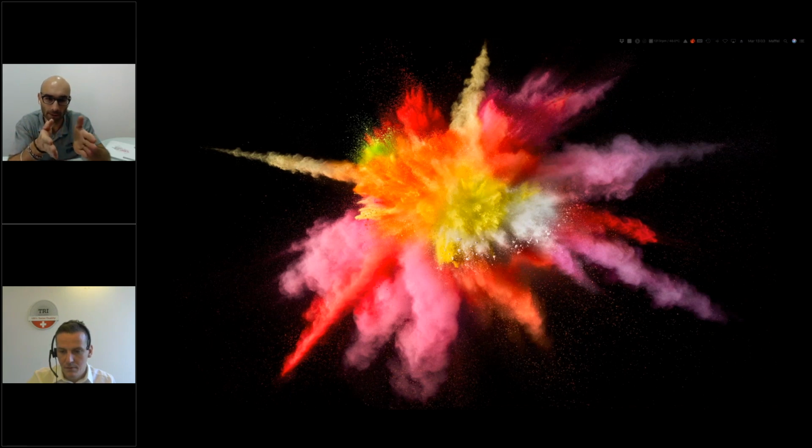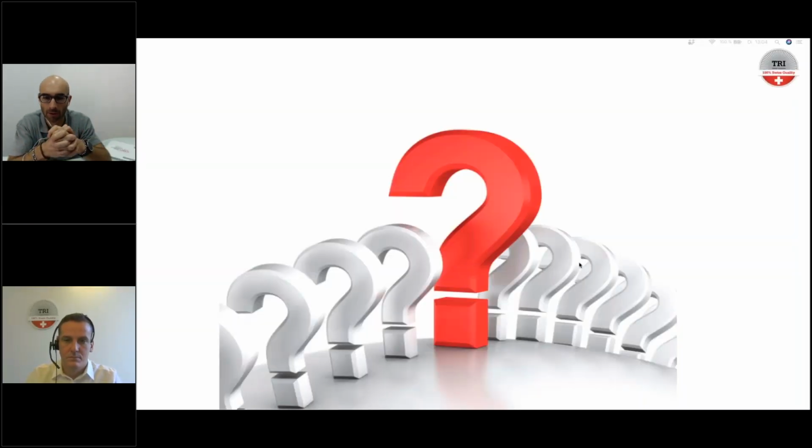The neck part of the T-base is very well polished, so you don't need to do another mechanical polishing. Usually, we prefer to create the transmucosal area with the restoration, especially with zirconia, because with zirconia we can have a very perfect surface after mechanical polishing, like a mirror polished surface. And this is the best way because the gingiva loves a polished surface a lot, especially with zirconia.